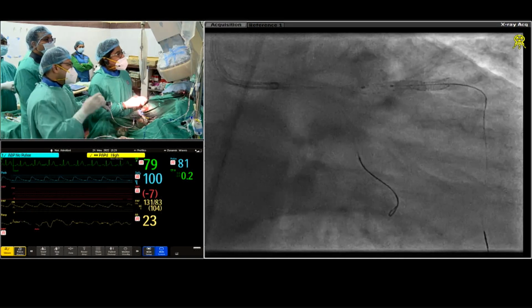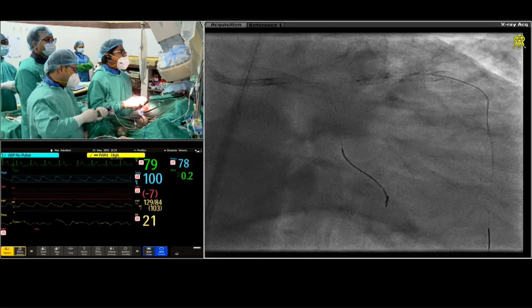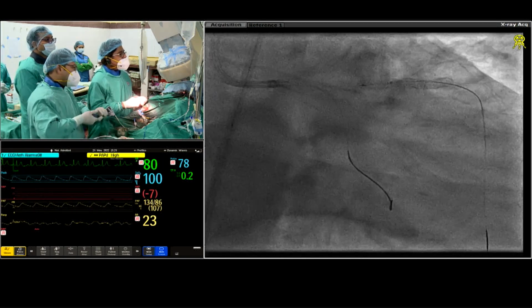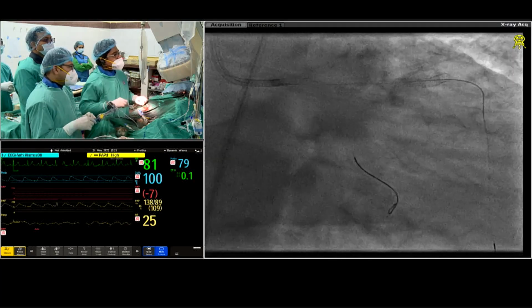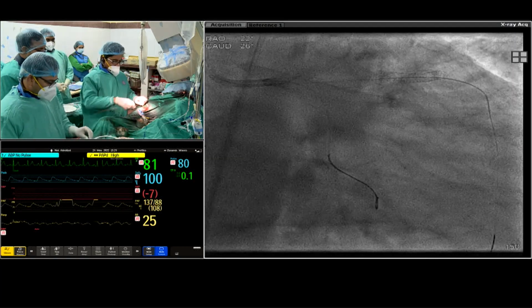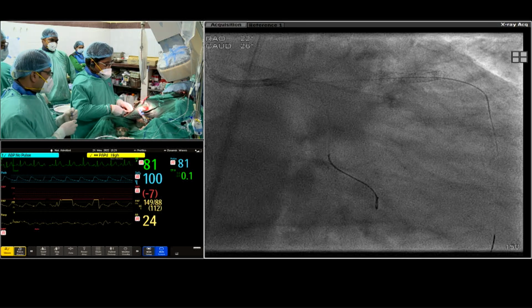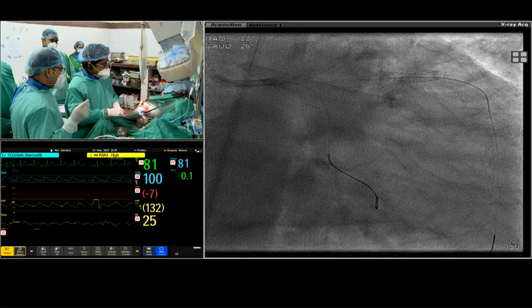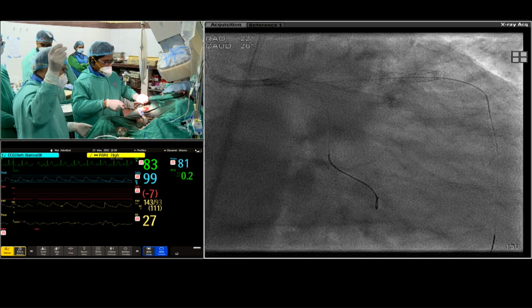Okay, do a little here also. 2, 4, 6, 8, 10, 12, 14. Down. I think that's enough. 3 in front will remain. Okay? I think this is done. Let's confirm the distal once that it is okay. Now let's see how it is.